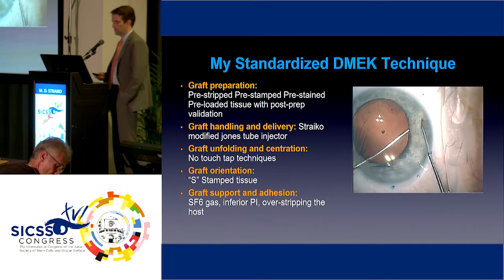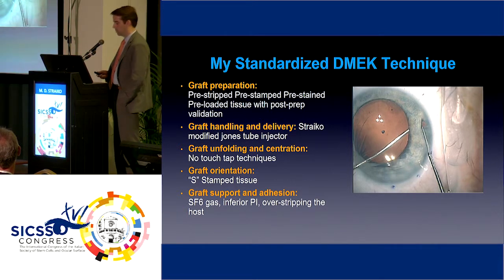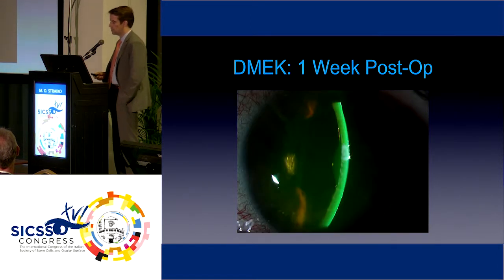Graft support and adhesion, we use 20% SF6 gas, as first reported by Dr. Guell. Place an inferior PI to prevent pupillary block with that gas, and overstrip the host relative to the size of the graft. So here's a 1-week post-op.